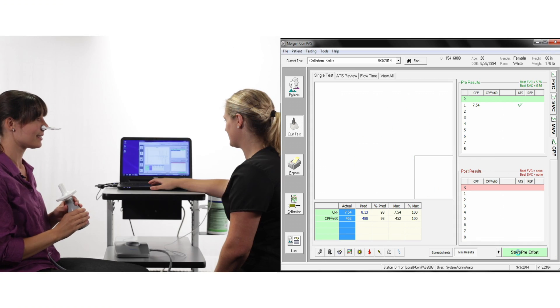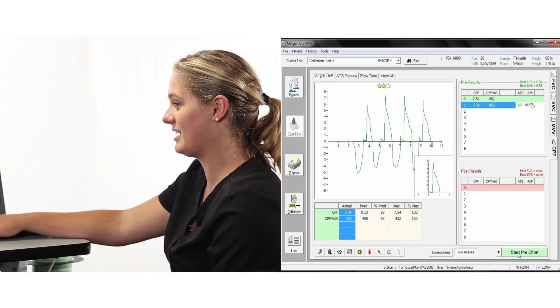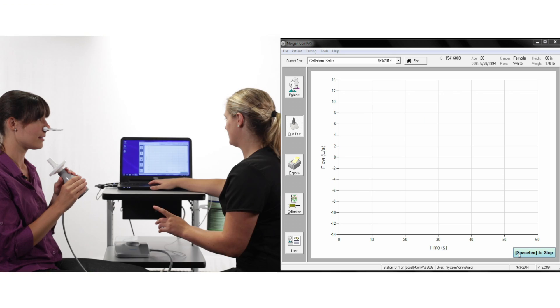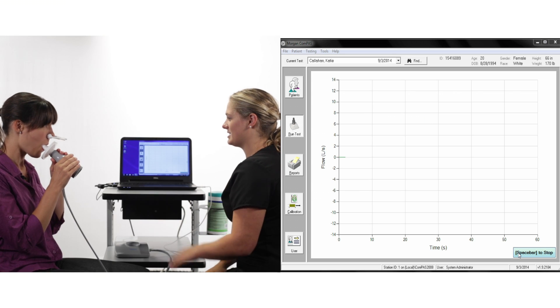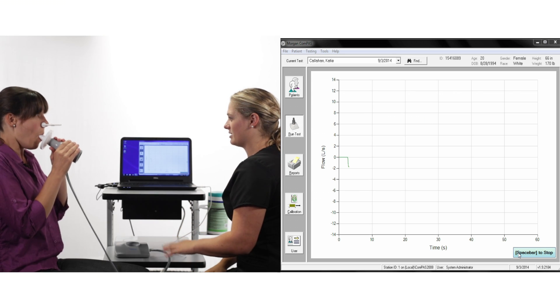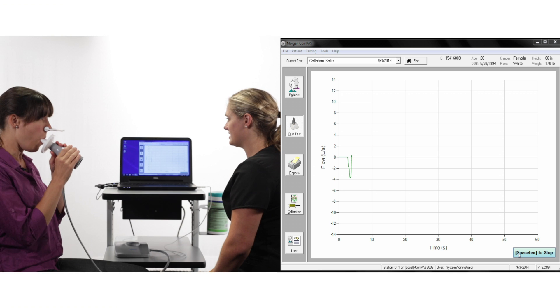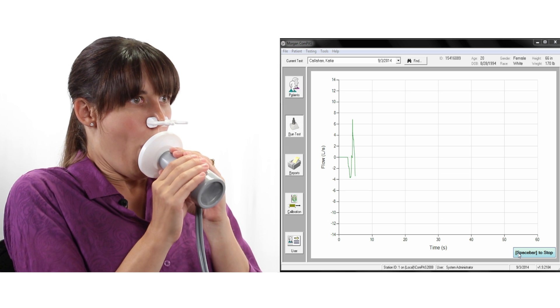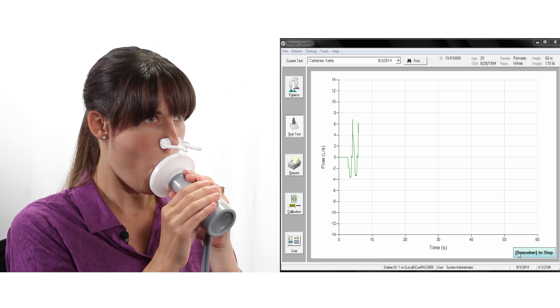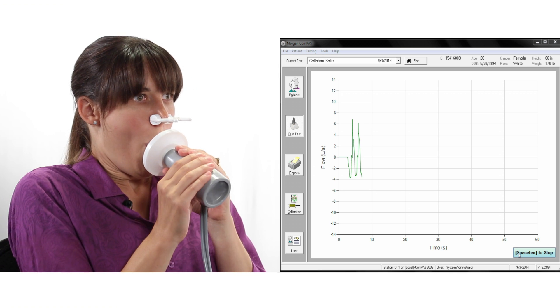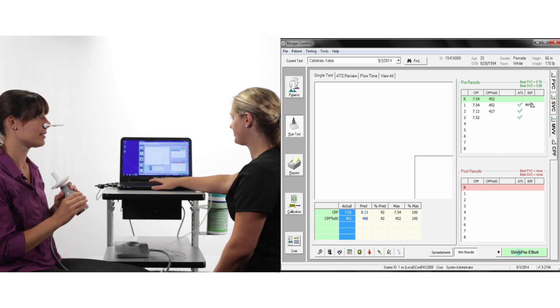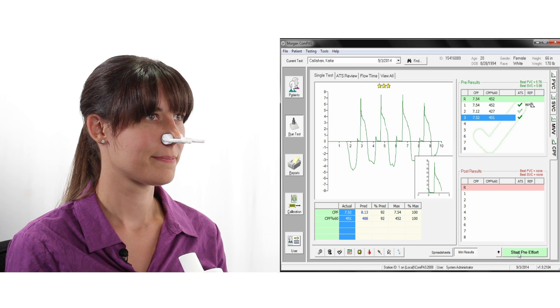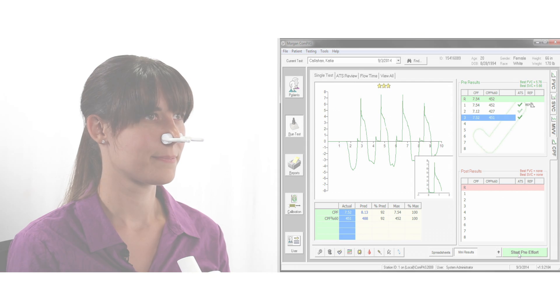This can be repeated on the same screen, capturing several maximal cough efforts. Once complete, press the space bar to end the test. Compass will automatically report the highest cough peak flow that has been recorded.